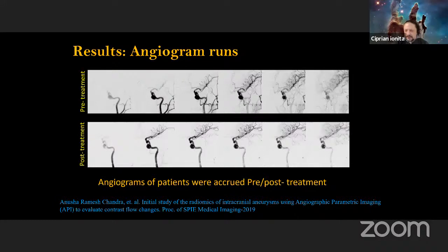There is not much I can do in here. If it decides that it's not done, some of them, like Dr. Siddiqui, sometimes place a microcatheter into this aneurysm dome over the pipeline before deployment and decide to drop a coil in, or decide to put a second coil in, or are wondering about it.